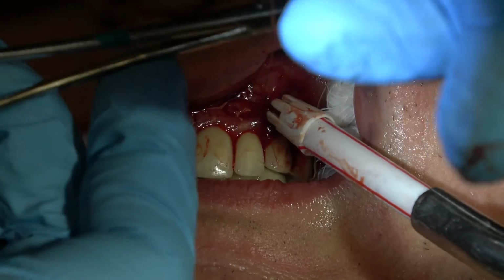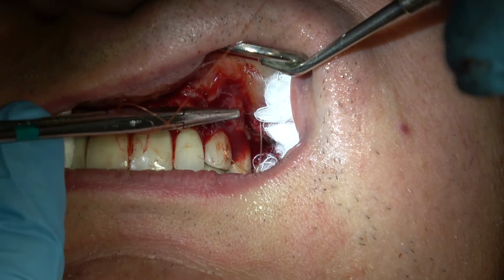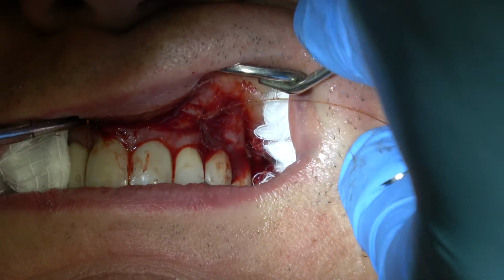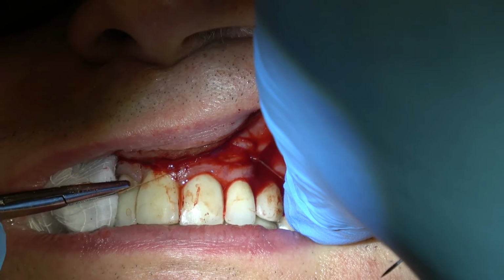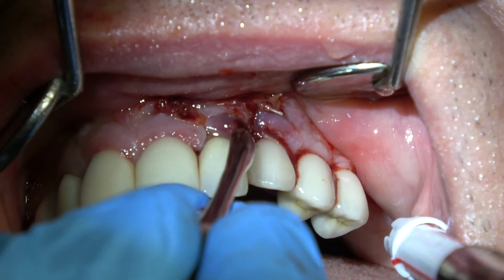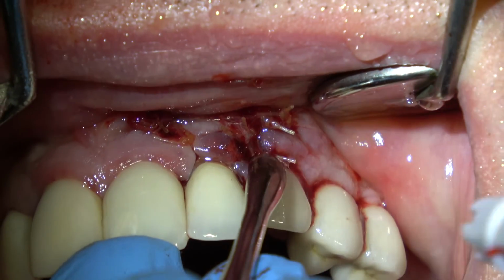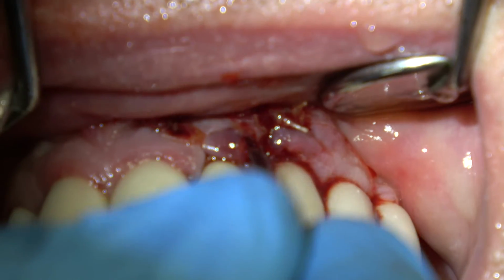You want to suture firmly but not tightly. If you put too much pressure on the flap, the suture will pull through. So I don't want a lot of tension on the flap. Reflect enough apically that you don't have too much tension on the flap. You can see this is pretty gnarly looking where the fistula blew through the sulcus. And we'll just have to see how that heals.